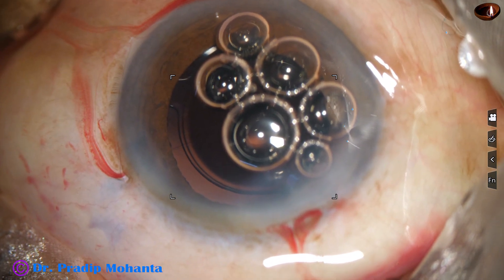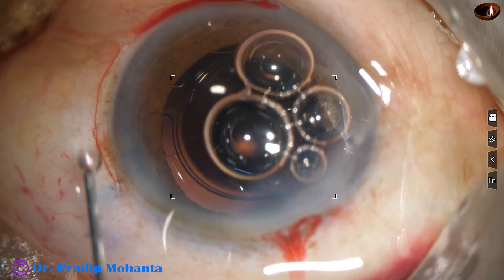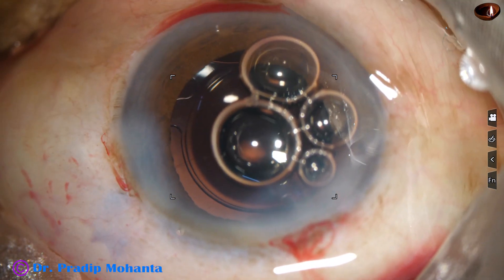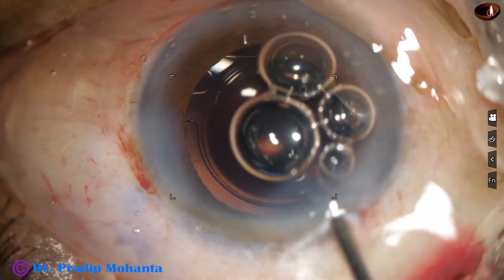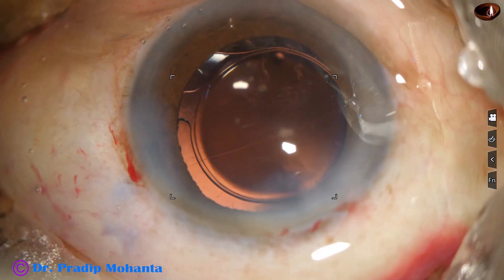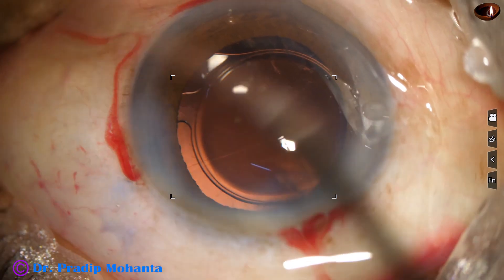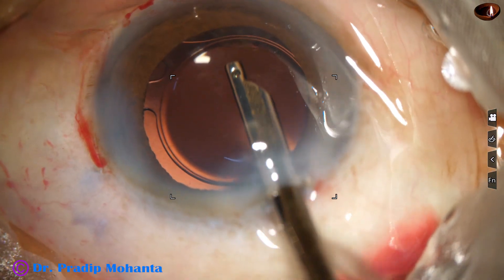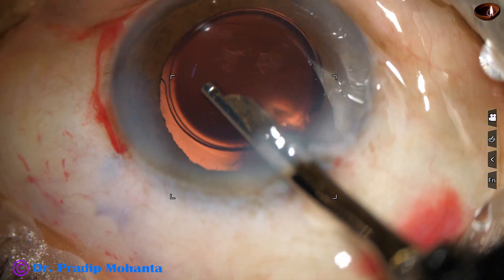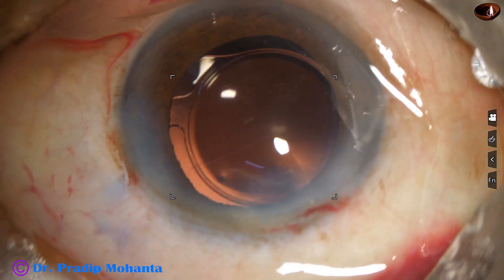Now a bit of moxifloxacin is injected. The side port at around 2 o'clock is closed by hydrating the corneal stroma. The side port at 7 o'clock doesn't require any hydration as it is made with a keratome and comes through the conjunctiva. Some cortex is seen at 7 o'clock, so I go with the Simcoe through the main wound and remove this cortex. The anterior chamber is formed nicely, the integrity of the wounds is checked, and the case is concluded.